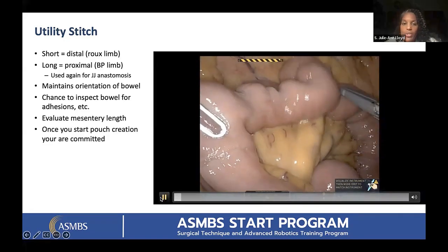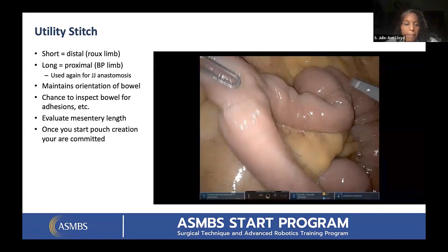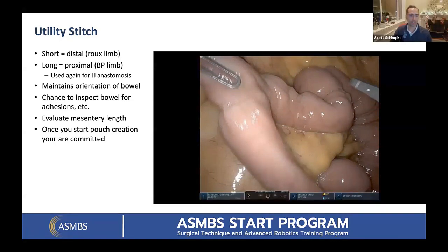So we have a question from the audience. Where do you put the sutures when you pass them into the abdomen? Like, where do you store them? Yeah, I put the Raytec up by the spleen just so it's handy. And I put all four sutures that I put in over by the gallbladder. So it's still accessible, but at the same time doesn't get in the way of the operation. So I put them over by the right lobe of the liver by the gallbladder.